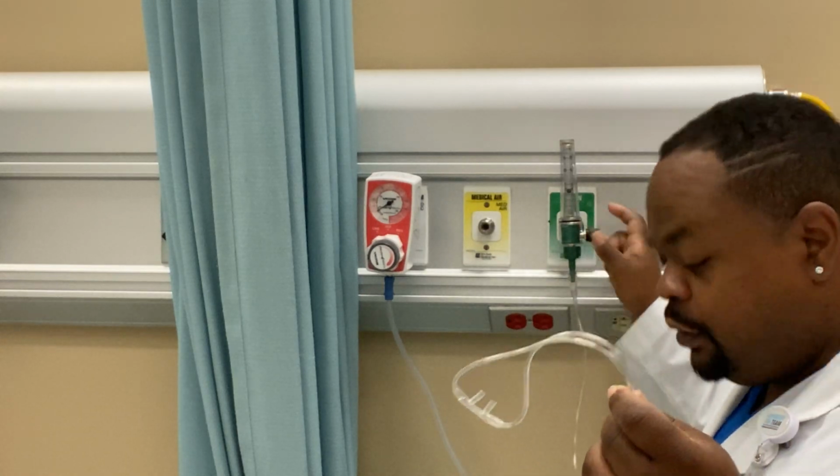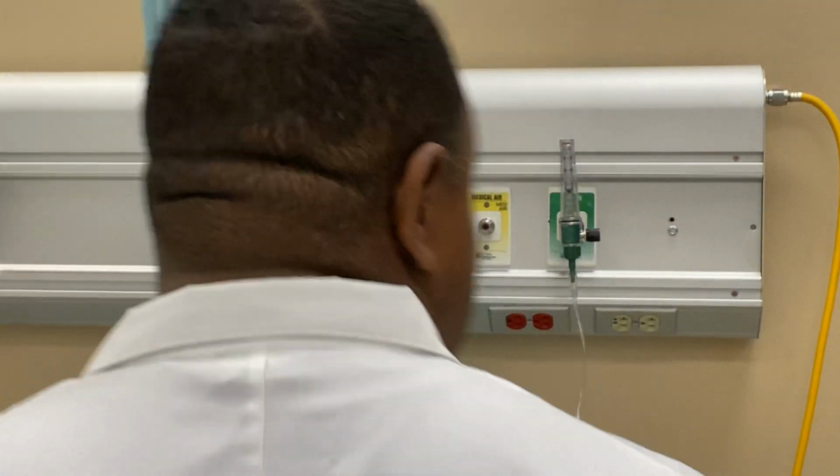All right, so I happen to have this now on 4 liters per minute. Now you can't hear it really, but if I put my fingers over it, hear that? So you do have liter flow, right? So this is what it would look like on your patient. Up in the nose and behind the ears. Then there's a little tension thing right here to kind of make it snug.